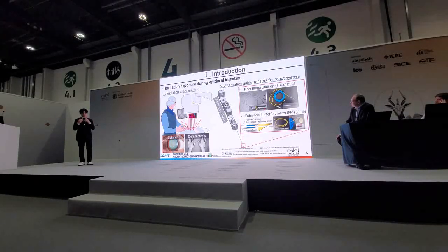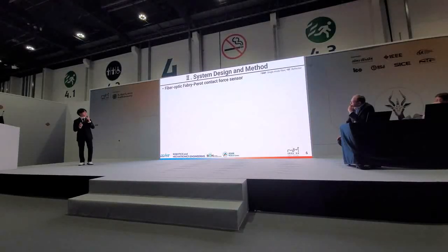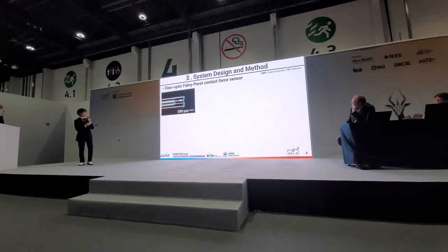To measure the contact force or the pressure, 2 types of interferometric sensors, fiber Bragg gratings and Fabry-Perot interferometers, have been commonly suggested. My system, based on the Fabry-Perot interferometer, can measure the contact force directly between the biological tissue and the surgical needle.